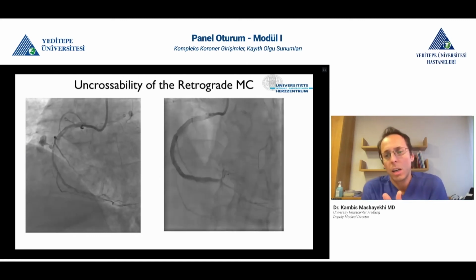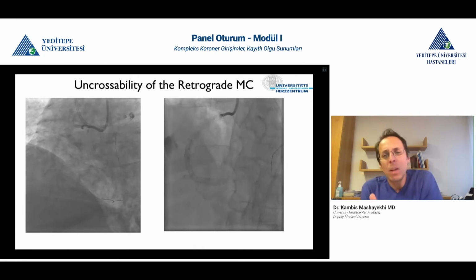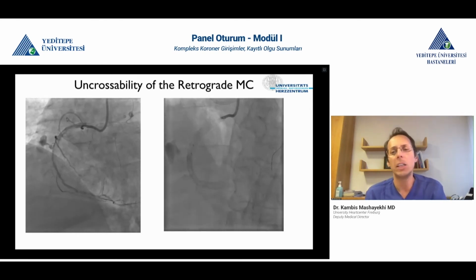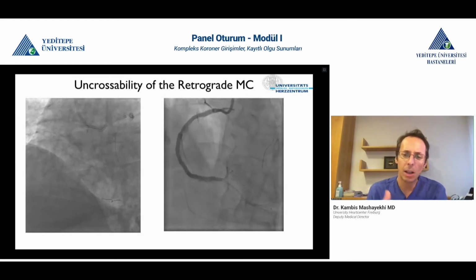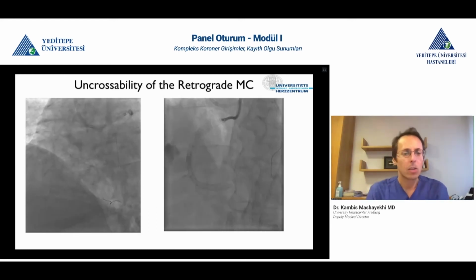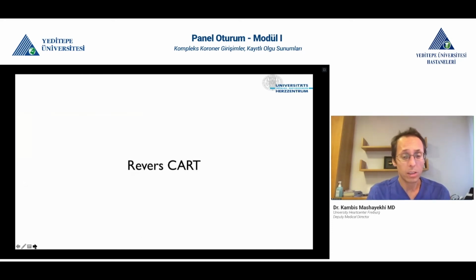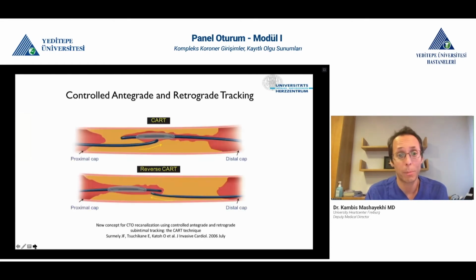So these are cases which are really at the limit of what we can do nowadays on very, very calcified lesions. It was a distal flush occlusion on the cap. And the patient is still actually fine. We even did a re-angio because he came for his legs 1.5 years later, and he was doing in a good condition. And the RCA, we had to do one drug-eluting balloon, but it was still open and patent.